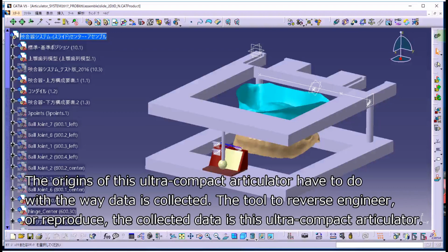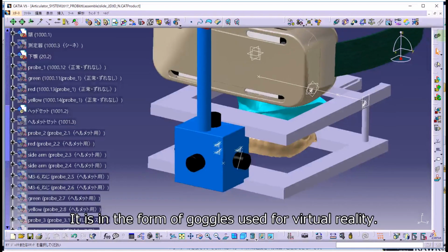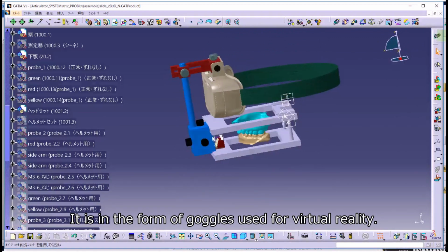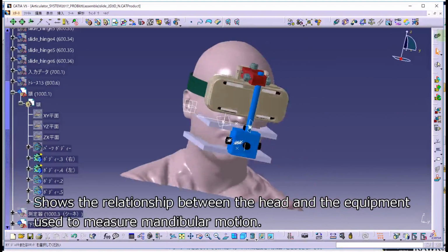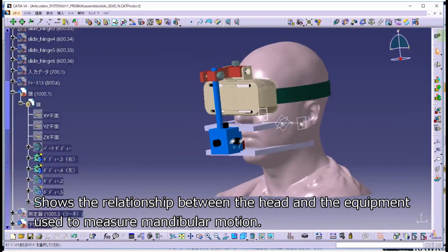The origins of this ultra-compact articulator have to do with the way data is collected. The tool to reverse engineer, or reproduce, the collected data is this ultra-compact articulator. Indicates the measuring instrument. It is in the form of goggles used for virtual reality. Show the head. Shows the relationship between the head and the equipment used to measure mandibular motion.